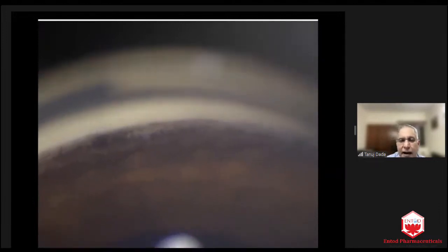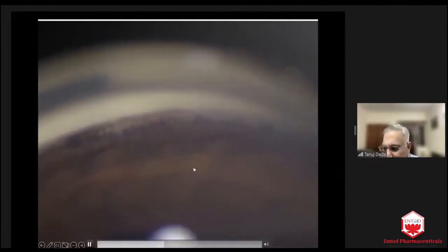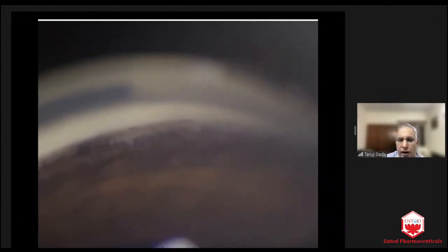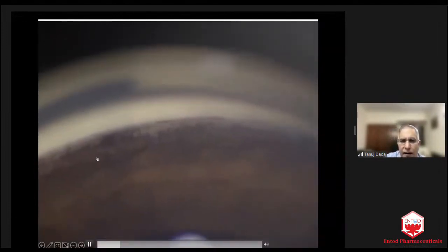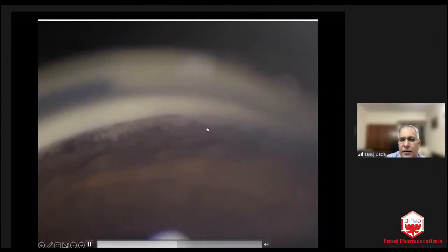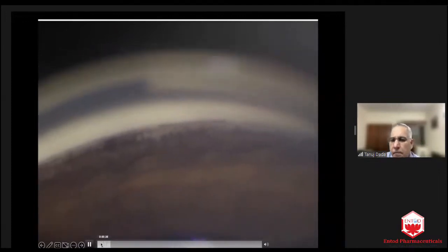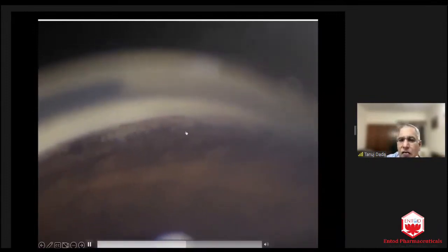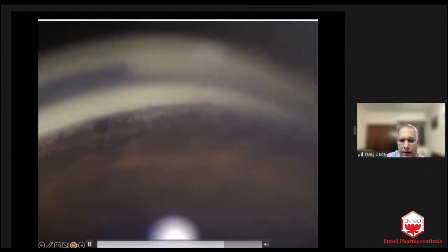So this may be slightly difficult for you. This is again a patient of juvenile open angle glaucoma. So here two findings are there: this prominent band-like Schwalbe's line and anterior insertion of the iris. So in the developmental glaucomas, the iris fails to recede from the trabecular meshwork. So that is why you get an anterior insertion of the iris. So that is a sign of developmental glaucomas.